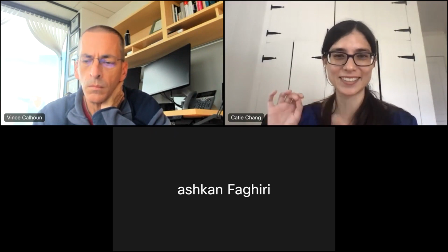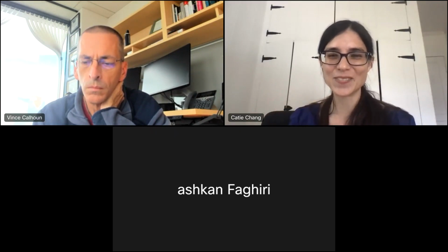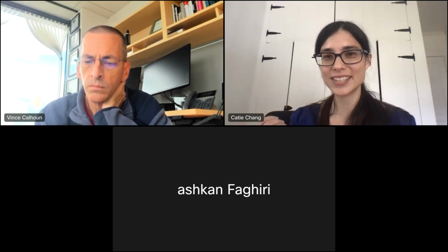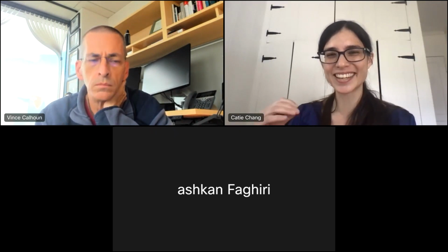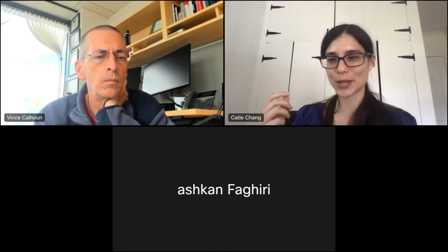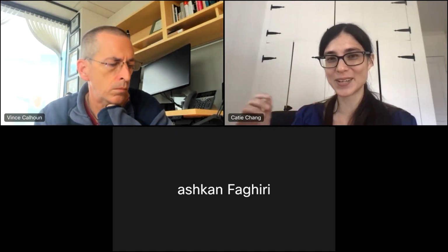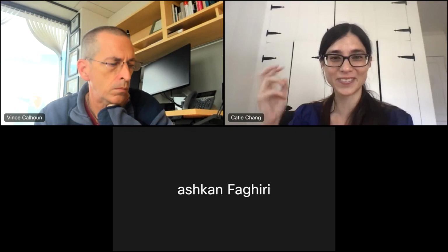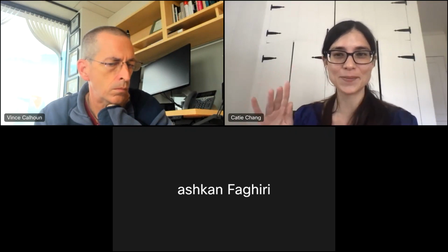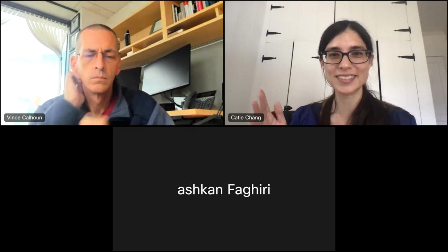So we couldn't sit and fix all the 400 subjects' data, so we actually just left some of those in. When we do the evaluation, that could hurt us a little bit, because in the best case, if what we're predicting is really good, but what we're treating as ground truth is actually a little bit noisy, then that can manifest as what looks like reduced performance.